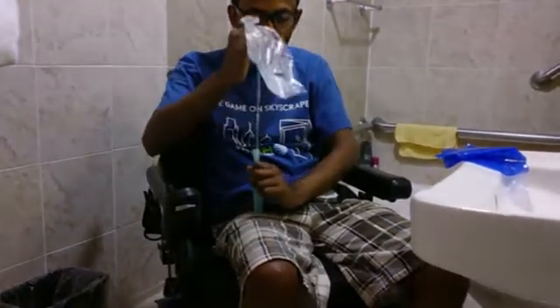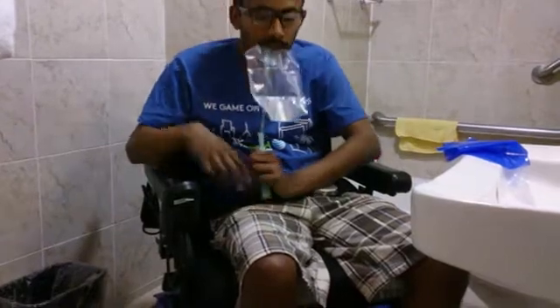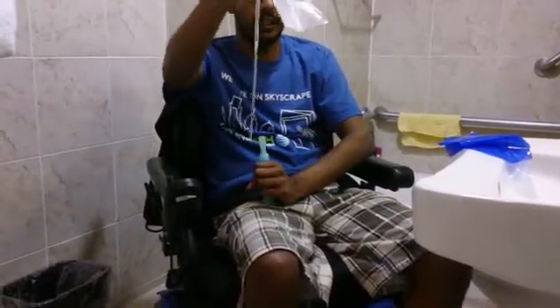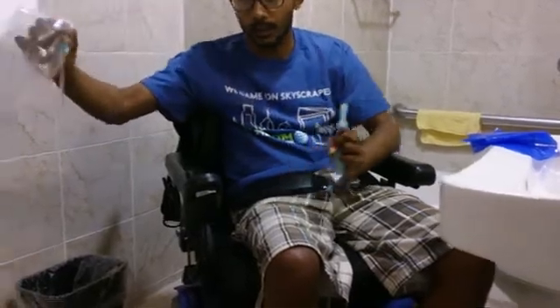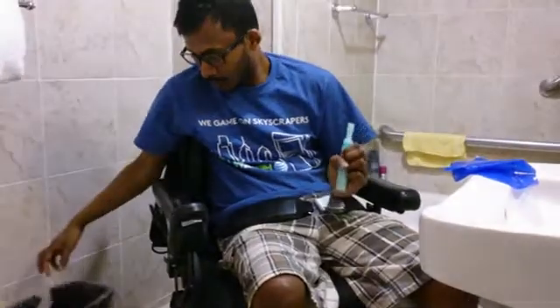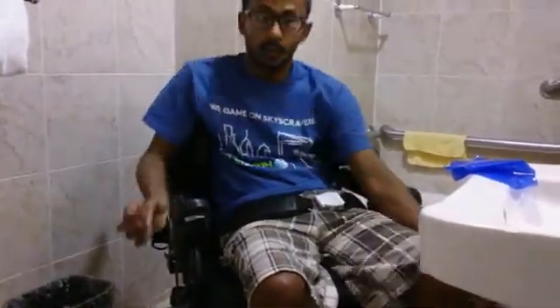I would just take the catheter off like this, and once the catheter is off I would just insert it. Once I'm done inserting, I can just empty the bag in the toilet and then throw it in the trash can. That's it! See more videos on self-cathing and bladder care on scivideoblog.com.